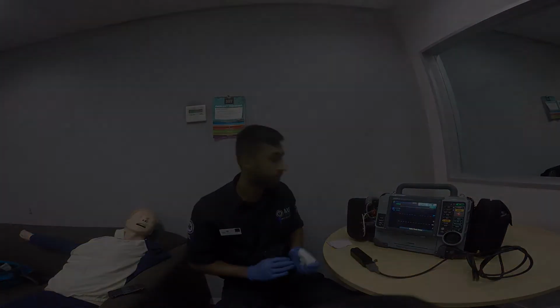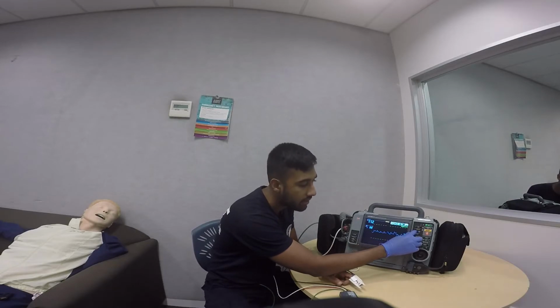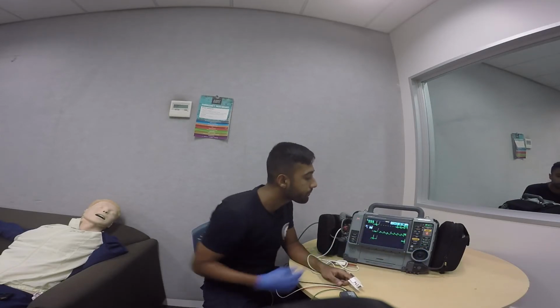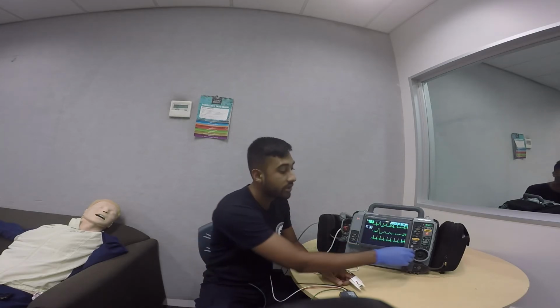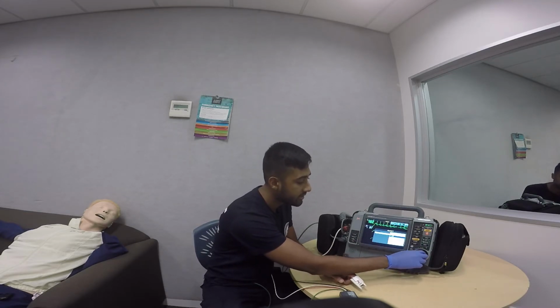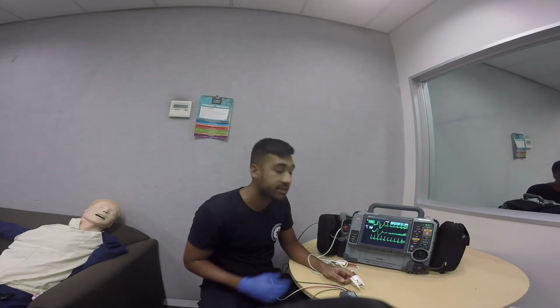Yep. So I've just attached a 3-lead ECG to myself as well as a SpO2 monitor. By default, the LifePack shows paddles. So in order to see my ECG, we'll hit lead, scroll down to leads 2, 1 and 3, and we can see my ECG. If we want to change the amplitude, we'll scroll onto one of the leads and select the sizing as needed, pressing the home button, and you can see it's much bigger.